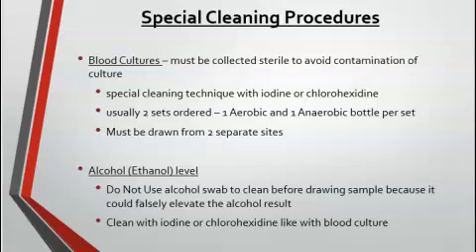Again, we're going to clean with either iodine or chlorhexidine instead of alcohol. And again, we're collecting 2 sets of bottles when we're collecting for blood cultures, and those blood culture bottles must be collected from 2 separate sites. For example, you can collect one from the left arm and you can collect one from the right arm.